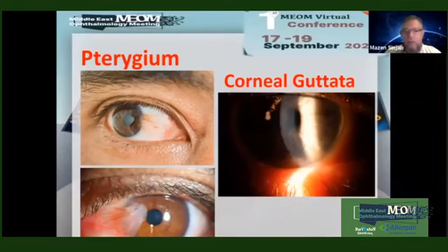If it is very small, no, I will go for the cataract. But otherwise, I will remove the pterygium first, and I will wait for 1 month if the cataract is significant. So no need to wait more than 1 month. But if the cataract is tolerable, then I would wait for 3 months, because this will give the cornea a better stabilization for the K readings and the astigmatism.